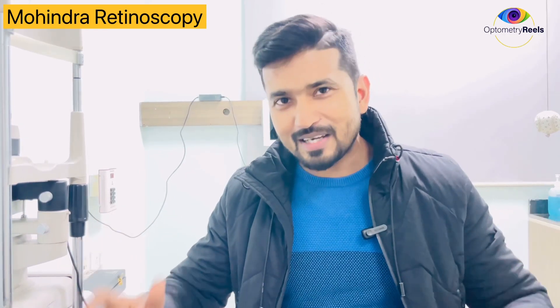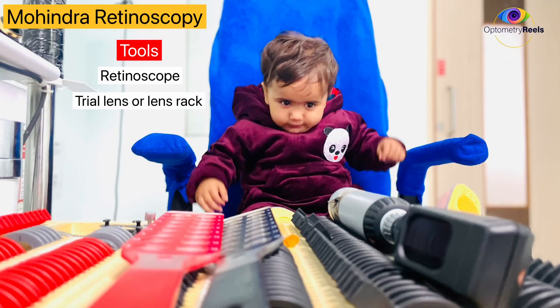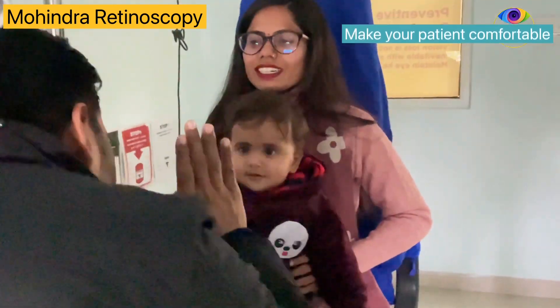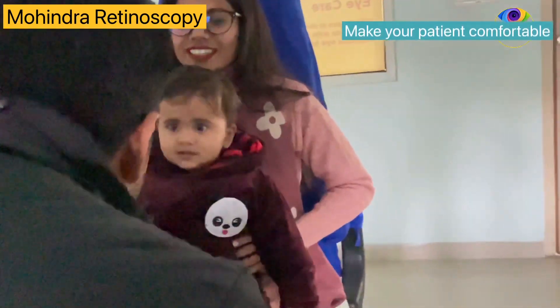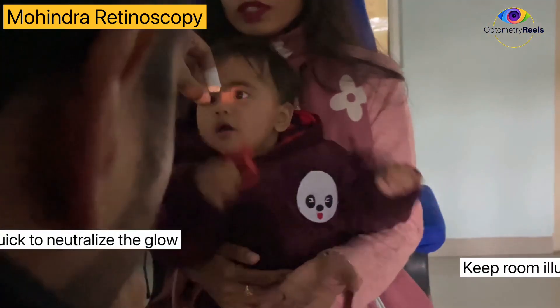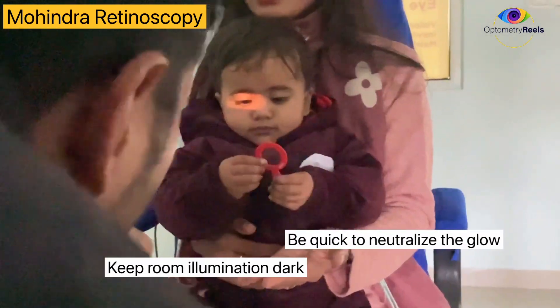Let me show you how it can be done on actual patients. This is a red colored lens — can you see the red colored lens?